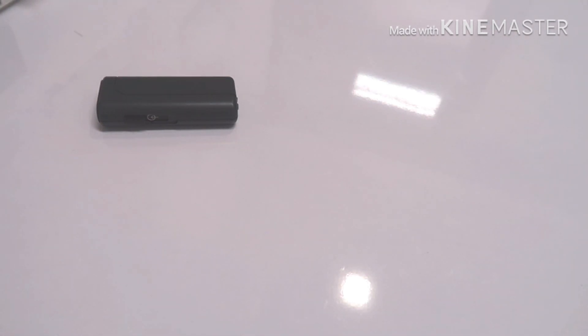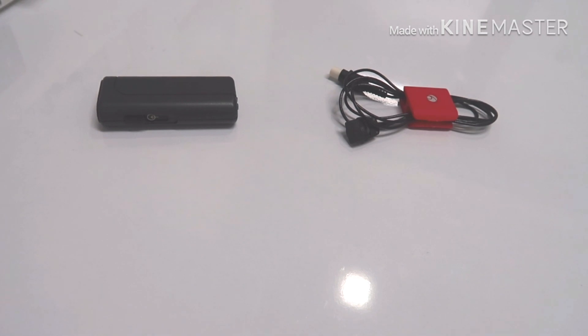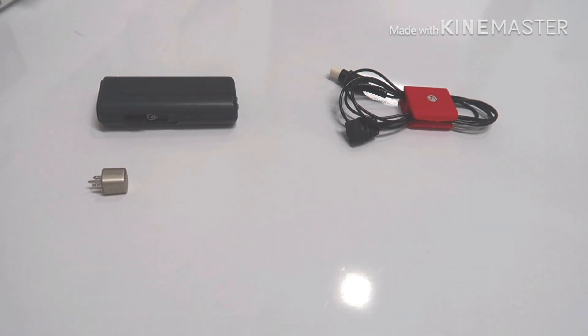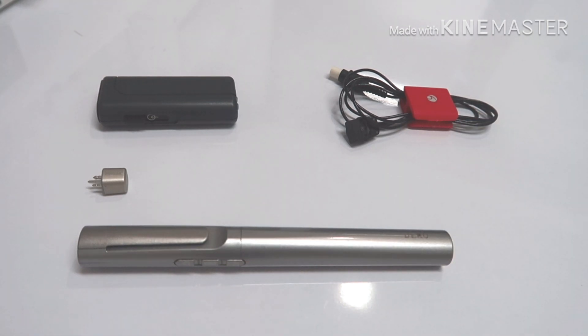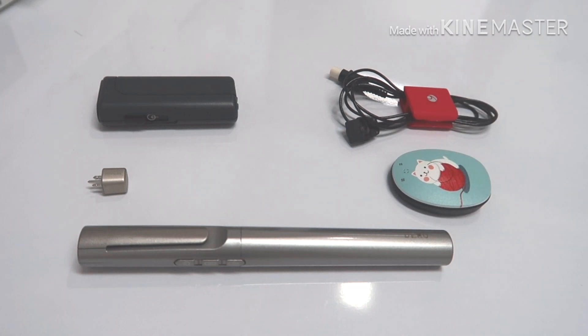Now, to begin connecting your Rondo 2 to your FM system, you need to have the following equipment. You need to have your mini battery pack, your mini battery pack to Rondo 2 cable, your FM receiver and transmitter, and of course your Rondo 2 audio processor. These are the basic elements for your connectivity.